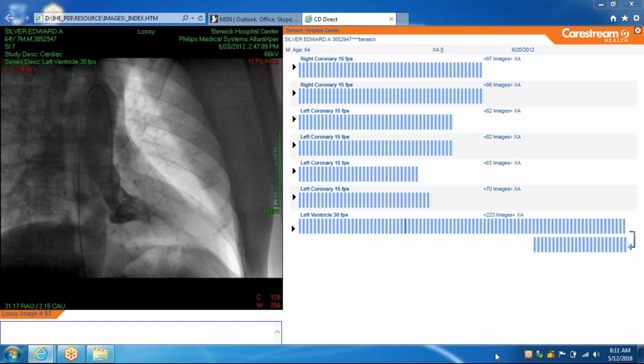So, say we use a femoral or radial approach and we get to the coronary vessels. Remember that the coronary arteries come off the coronary cusp. So the right coronary artery comes off the right coronary cusp, and the left main coronary artery comes from the left coronary cusp.